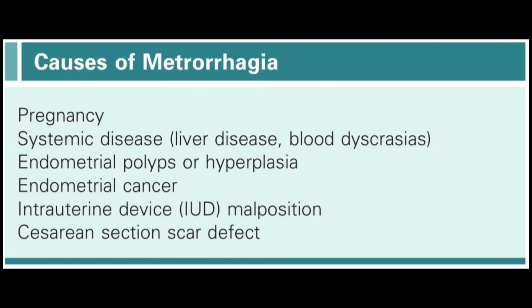Intrauterine devices, due to malpositioning or when embedded in the myometrium, can lead to metrorrhagia. In the case of cesarean section scars, infection, hyperplasia of the scar, abnormal collections, or hematoma can penetrate and cause metrorrhagia. These are the main causes of metrorrhagia.